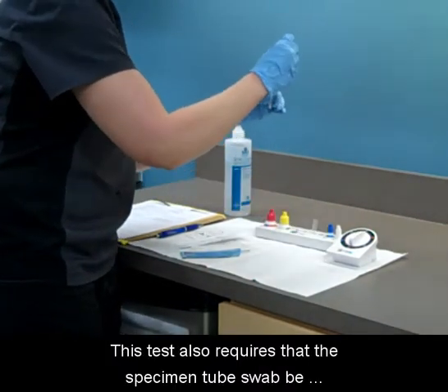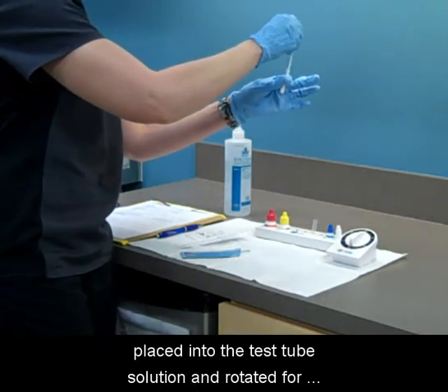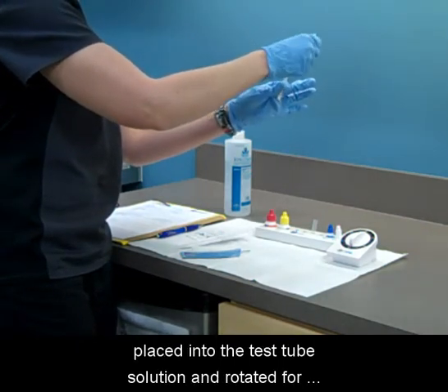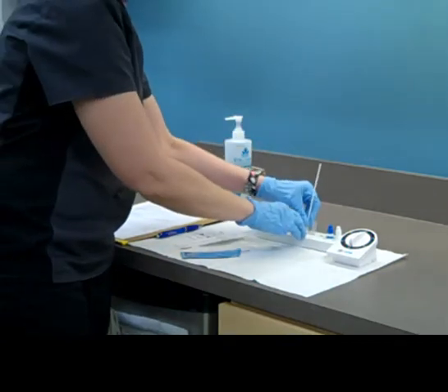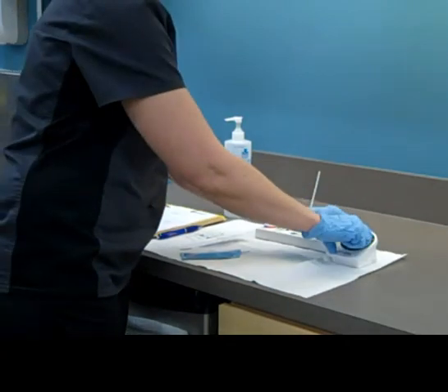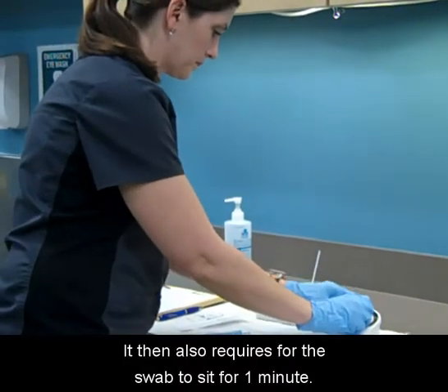This test also requires that the specimen tube swab be placed into the test tube solution and rotated approximately 10 times. It then also requires the swab to sit for one minute.